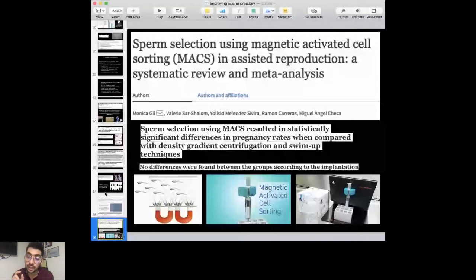If you're wanting to check for the DNA integrity and you don't have those warmers, I would recommend using the HBA slide, which is hyaluronan binding assay slides. These use the same principle as PICSI. What you do is you just load a drop of sample on the slide, which is already coated with hyaluronan, and let it sit for a time. And then what you're wanting to analyze is the amount of sperms which are going to stick to the dish. The percentage of sperms that are sticking to the dish and still moving actively, the tails moving actively, should be over 58%, or actually over 60%. So that is something that you can use, but it is a costly slide. So again, your cost implications would come to the patient.